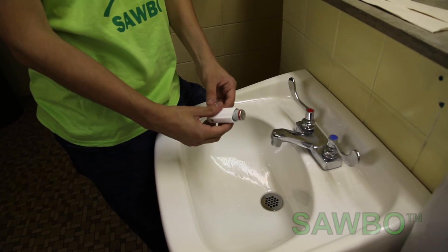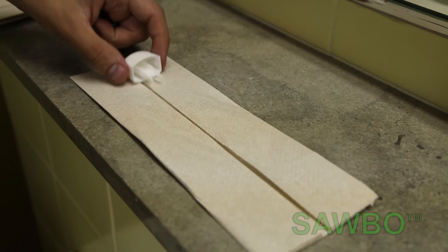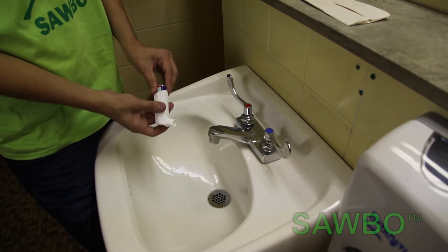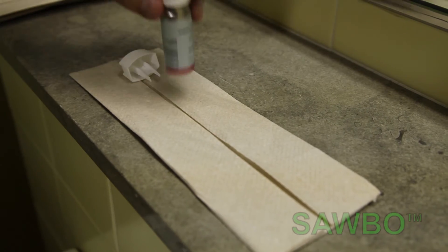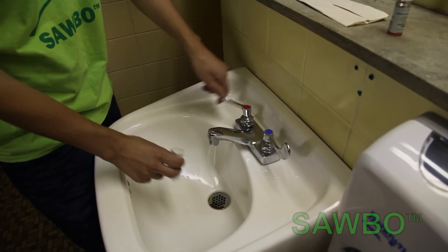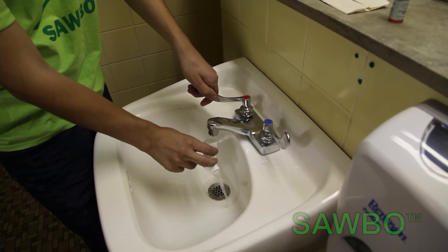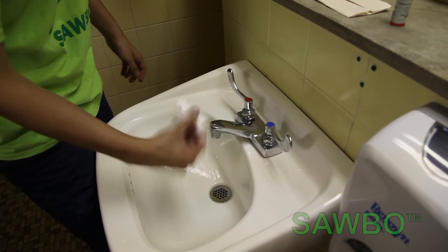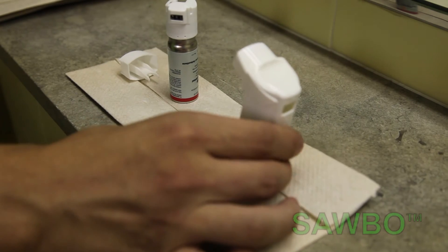Make sure to wash your inhaler properly. To do this, first disassemble your inhaler. Place the medicine cartridge aside. Next, run clean water through the inhaler shaft and in the cap. Finally, set the inhaler parts on a towel to dry overnight.